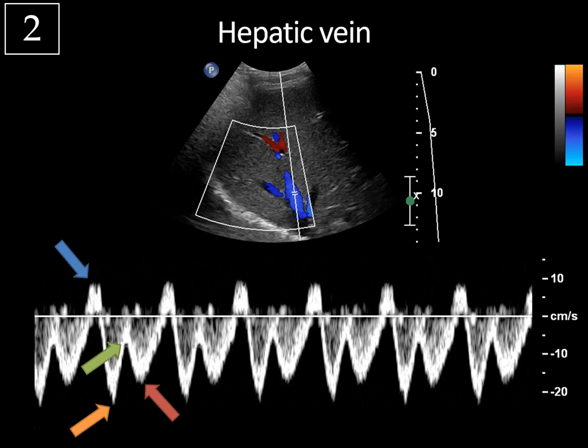Let's talk about these different peaks. The first one above the baseline is the A wave — that's blood flow towards the liver, representing atrial contraction causing increased right atrial pressure, occurring at the end of diastole. The next wave is the S wave, below the baseline — blood flow towards the heart. During ventricular systole, ventricular walls contract and blood exits the right ventricle, creating negative pressure in the right atrium that sucks blood out of the liver. This wave is caused by the downward motion of the atrioventricular septum during mid-systole with decreasing right atrial pressure, giving you the largest downward pointing wave in the cycle.